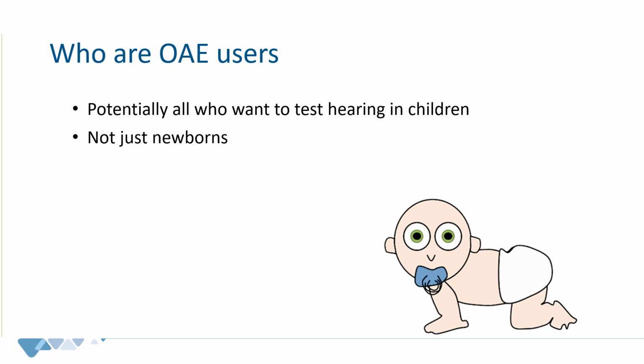When I was in clinic, from 2000 to 2008, we made it standard to do OAEs on every child that we saw. Not only because we wanted to learn about OAE, but also because it gave that confirmation that when hearing was normal, it was really normal. When hearing was not normal, we could see when the OAE really disappears or when you have just small OAEs. So we used it not for screening, but more diagnostically. And I think it's good practice that, just like you do tympanometry on children, you should also do OAE on children. That is the way it's moving.